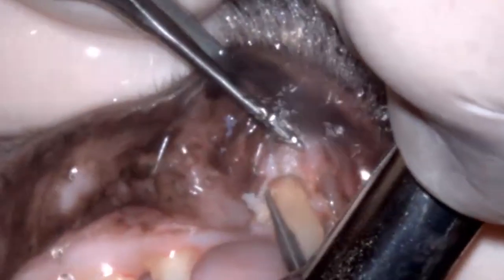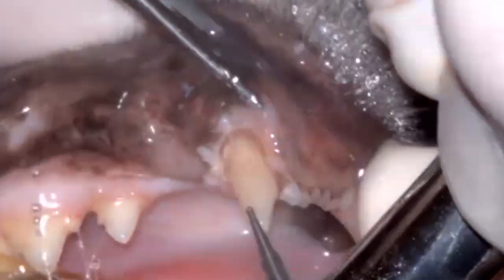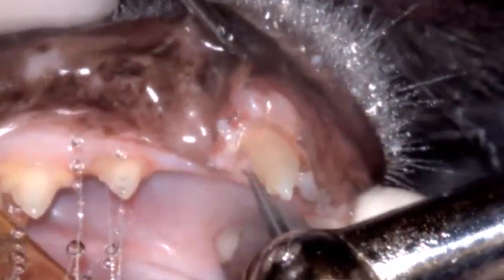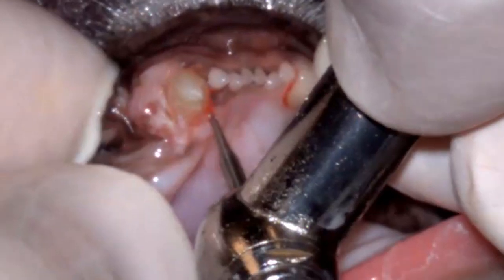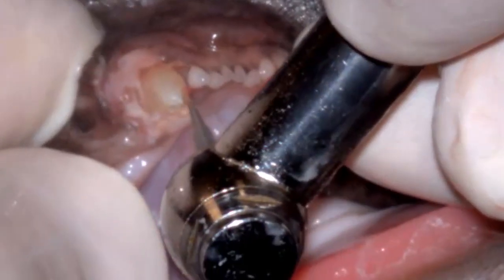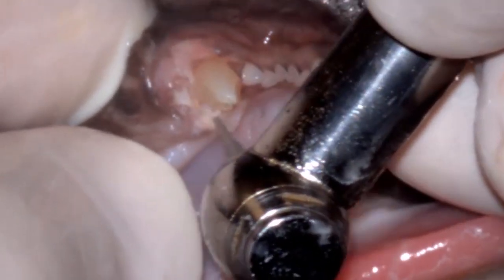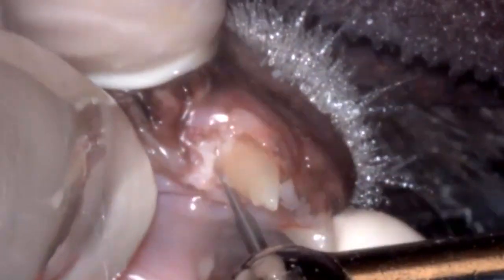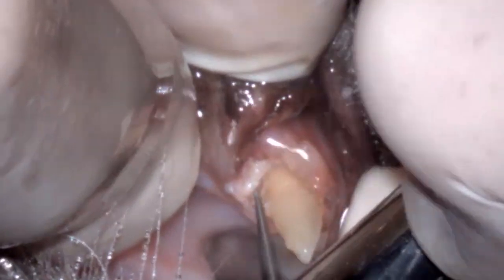I use this moating technique quite commonly. Rather than removing a lot of the alveolar plate, I prefer to drill a small moat around the tooth. I feel this weakens the jaw less than removing large quantities of bone and exposing the root more dramatically. Moating is useful to start extractions of large teeth where the periodontal ligament space is very narrow and wouldn't allow the entrance of a dental elevator. It's also great for removing retained root remnants and teeth that fracture during the procedure.